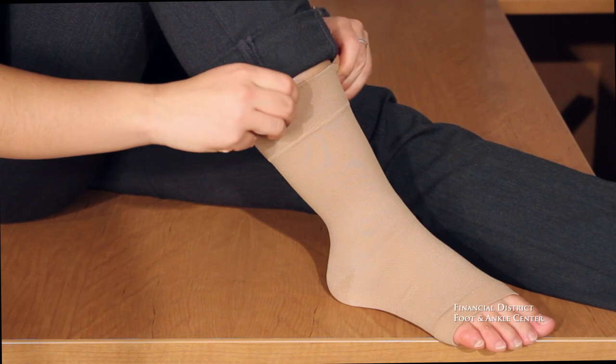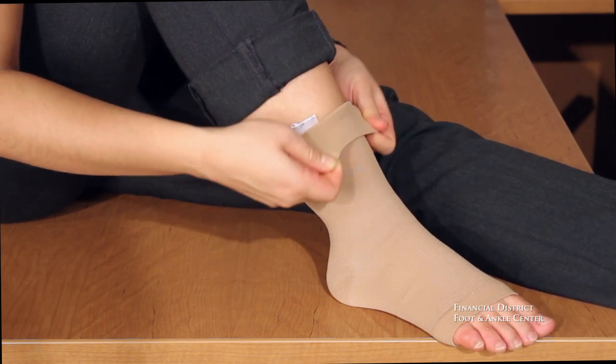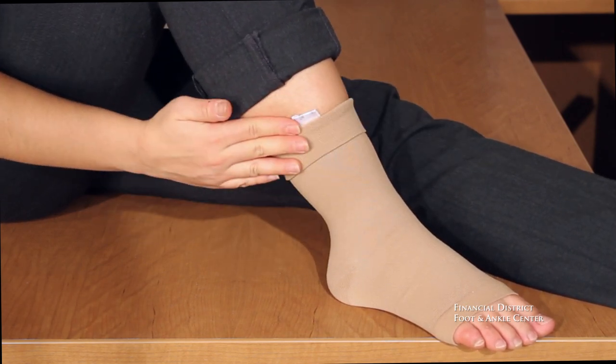If the compression sleeve is too tight on your calf, you can roll it down slightly for a more comfortable fit. At FDFAC, it is our job to get you back to your goals. So if you have any questions or you'd like to make an appointment, please call our office.